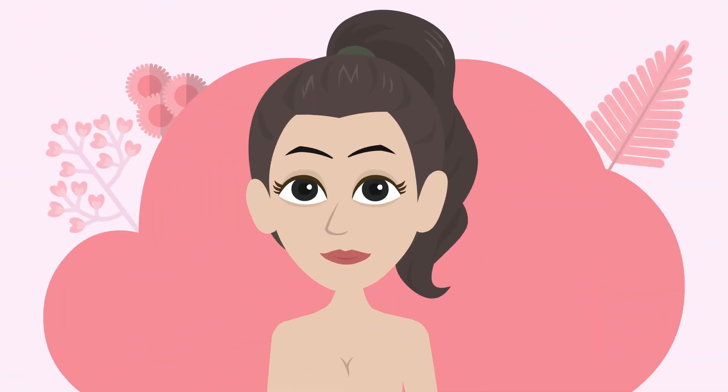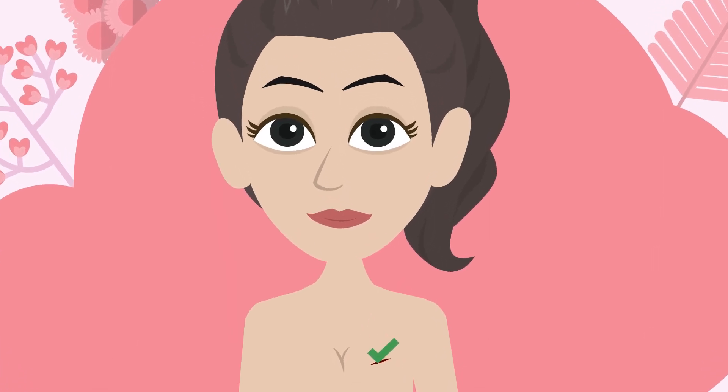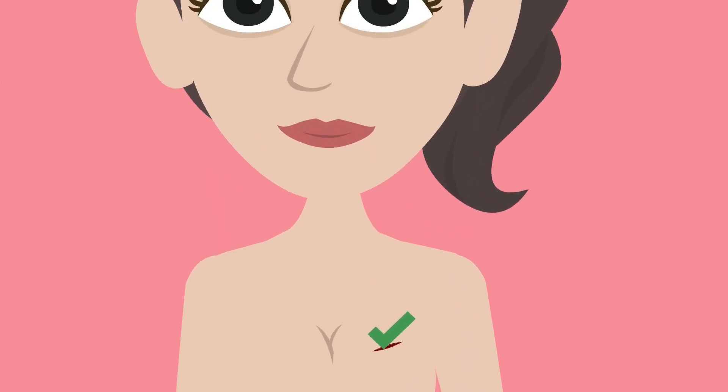When the tumor is removed, it's best practice to mark the cavity so the precise boundaries can be determined by the radiation oncologist who later delivers radiation treatment.